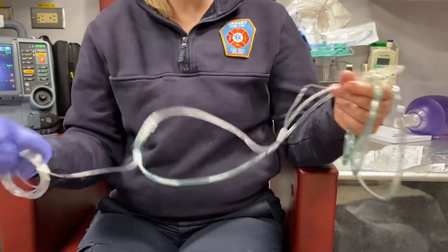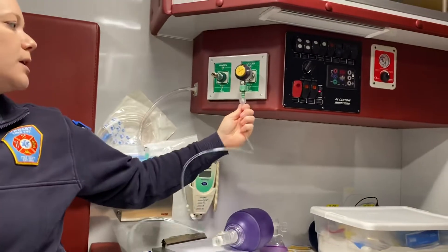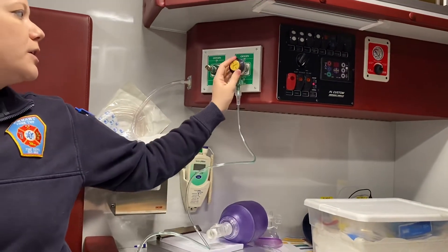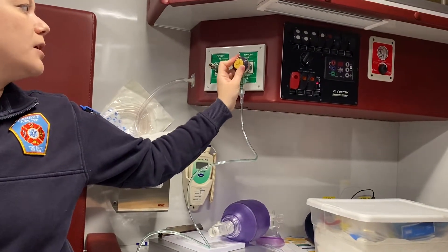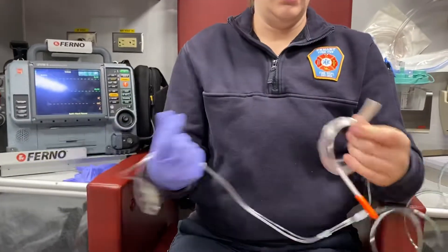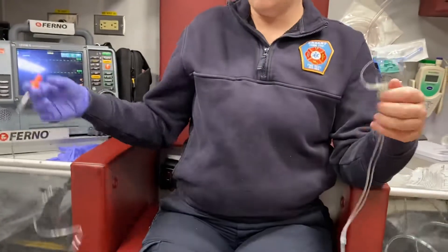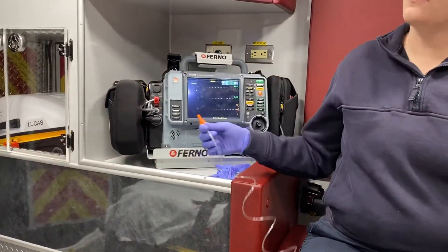Or you can use them together, so you could get oxygen delivery and the waveform capnography function simultaneously. The first thing you want to do is hook up your oxygen tubing to your flow regulator, then set your flow to whatever rate you would like.